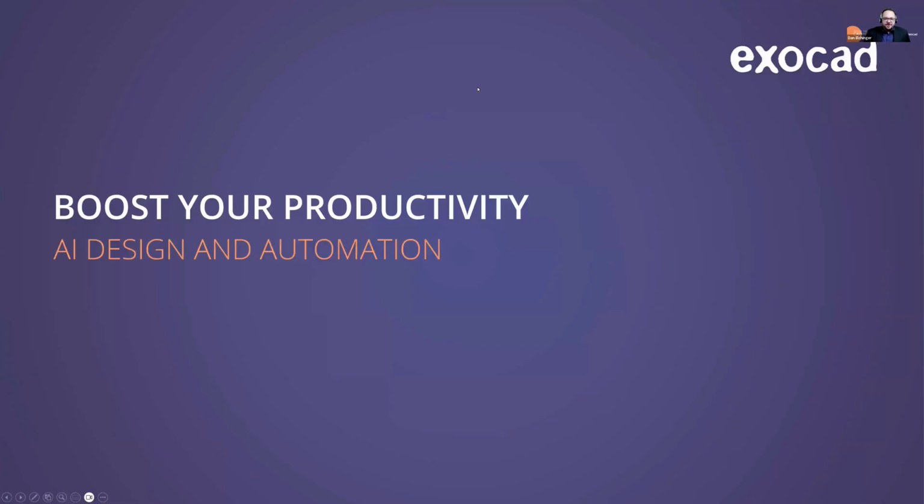So speaking of productivity, AI design, that's a new feature for us with our software. And we've always had a lot of automated features and settings to enable, so we'll cover some of those as well.